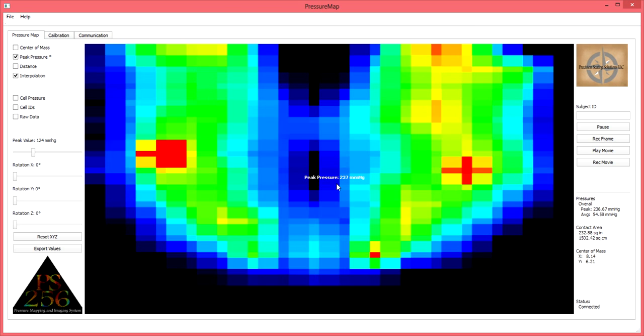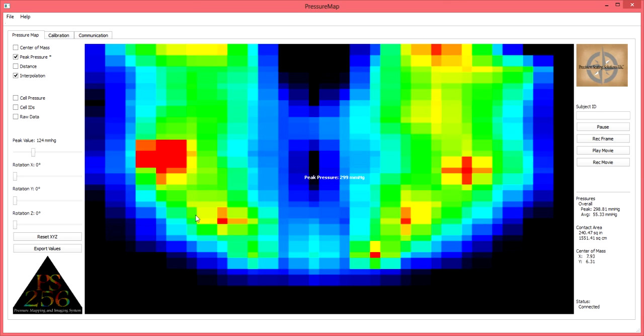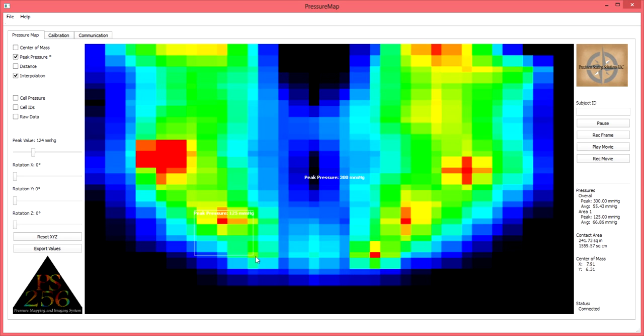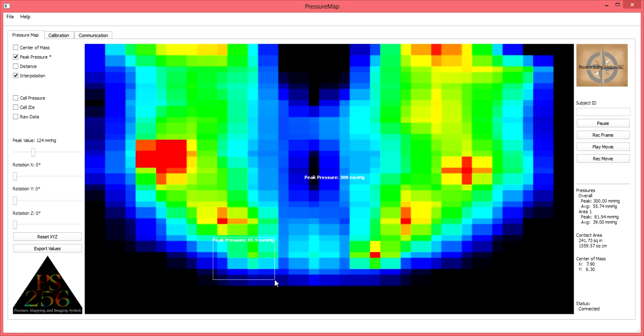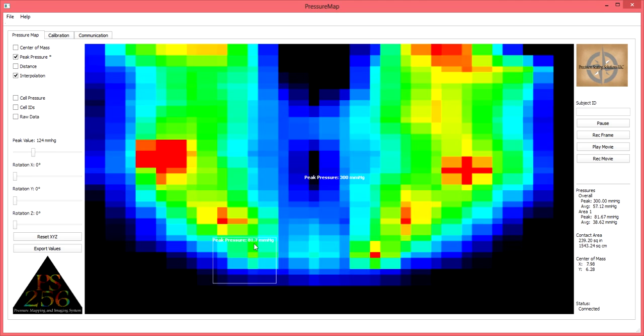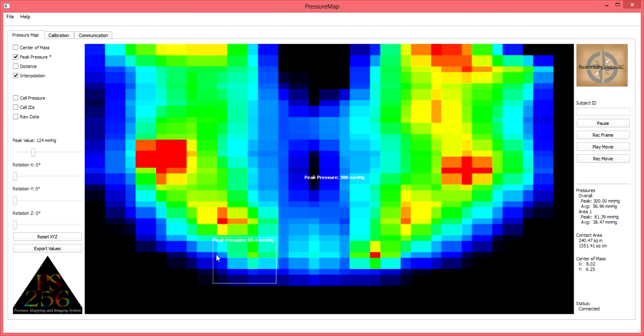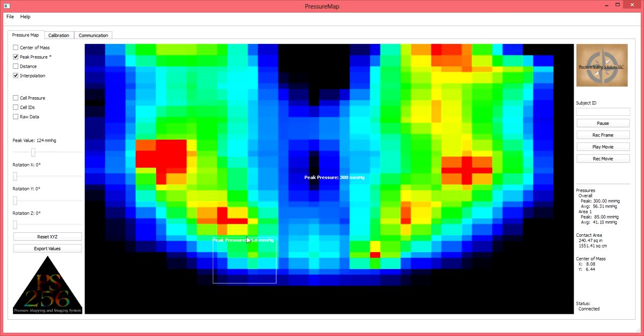To provide the first peak pressure box, move your cursor to the image, click and drag with the left mouse button to create a box as you see here. Above the box, you will see a peak pressure reading, which is indicative of the highest amount of pressure being exerted specifically within the area of that box.